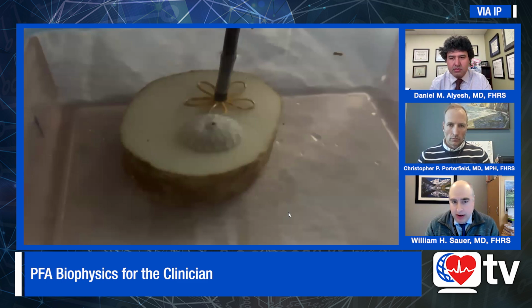We use a potato model in our benchtop studies. When we deliver the energy and we're touching metal, you can see arcing. You can actually physically see the flashes of light. We're conducting a series of experiments. One of the things we've noticed is when we see this, the lesions are much, much smaller. Why is that? Because the energy has been dissipated into a light show. It's no longer being focused into the targeted tissue.